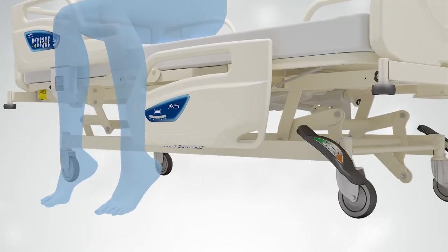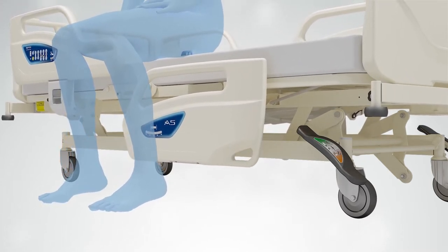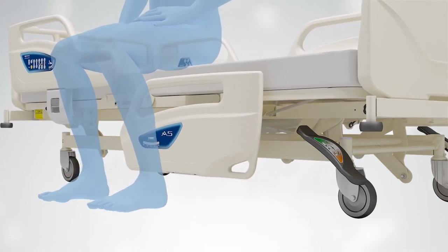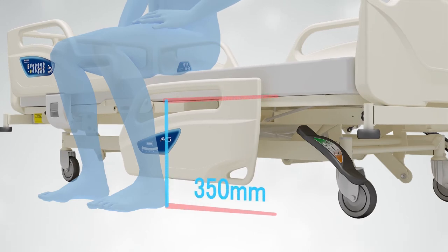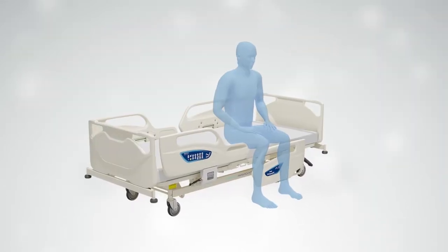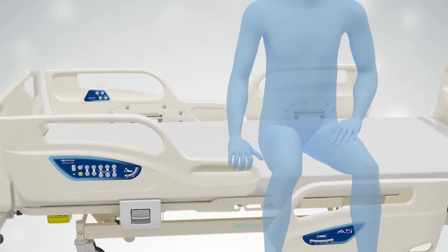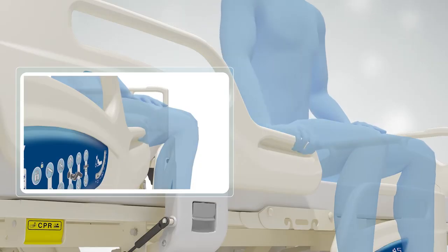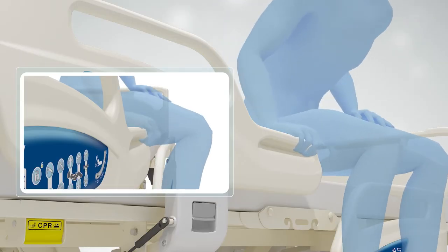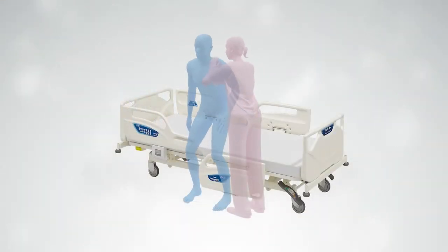The Paramount Bed A5 series places the utmost priority on the comfort and safety of the patient. We've selected a bed height of 350 millimeters, allowing the patient to feel the floor solidly beneath them when getting out of bed. Also, the strategically placed side rail can assist the patient if they need an extra boost while making an effort to stand up safely. This extra stability while helping the patient also lessens the burden and potential risk of medical personnel involved.